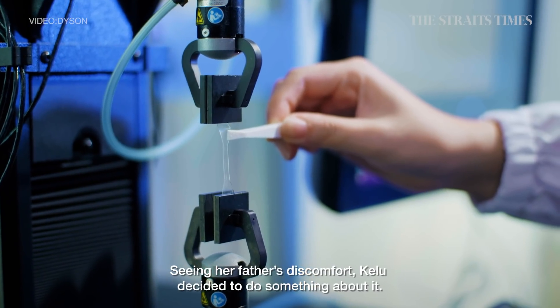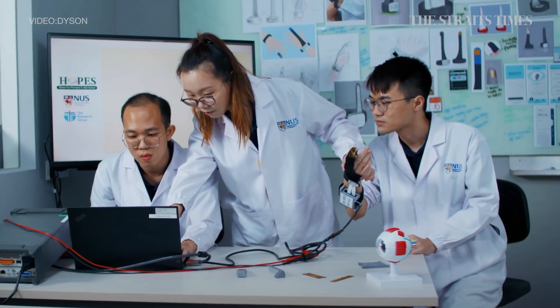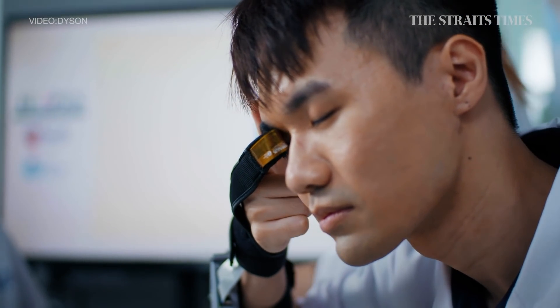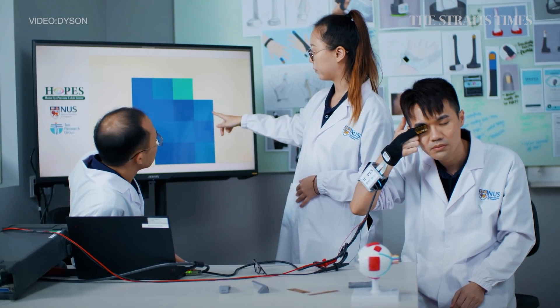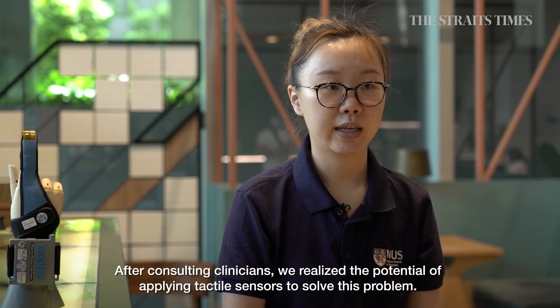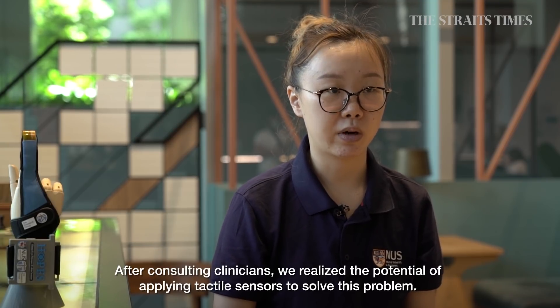Seeing her father's discomfort, Koh Lu decided to do something about it. Together with two other NUS students, they designed a glove that tests for glaucoma minus the discomfort and inconvenience of the standard eye pressure test. After consulting clinicians, they realized the potential of applying tactile sensors to solve this problem.